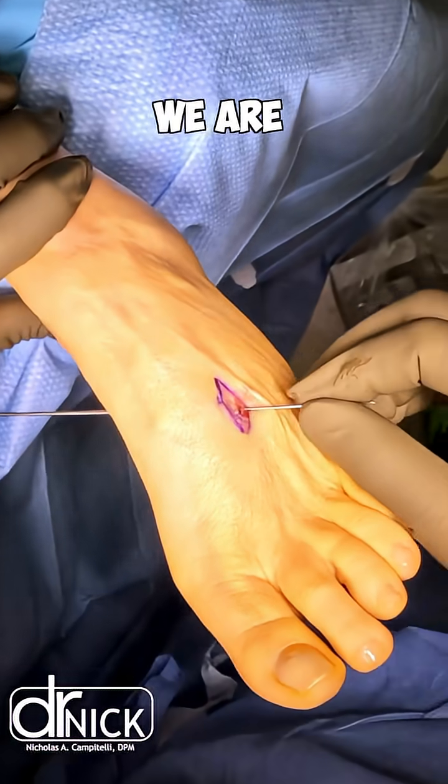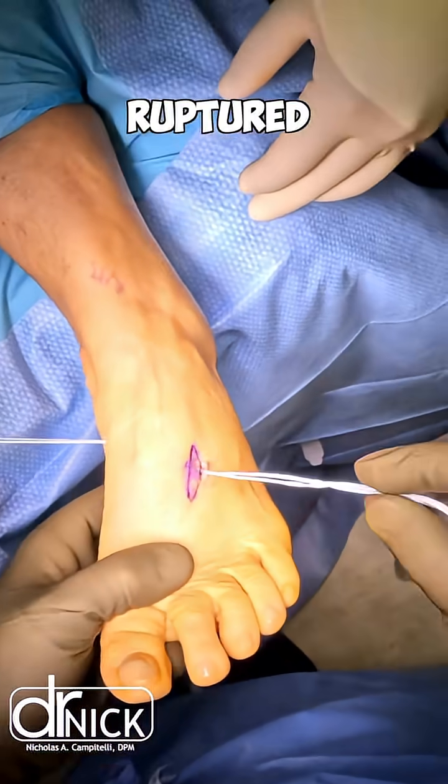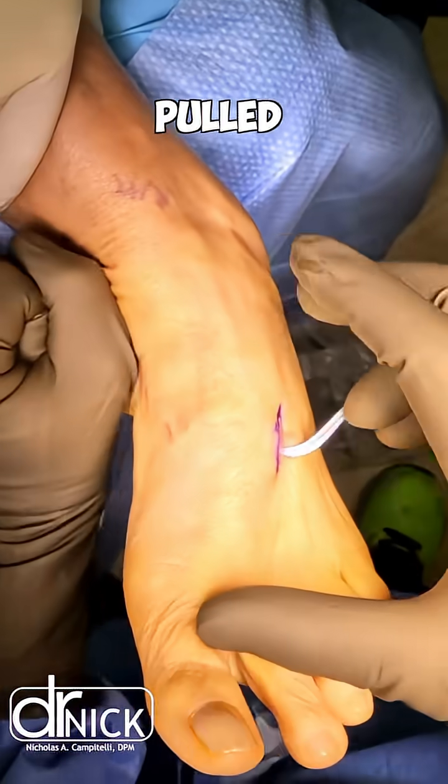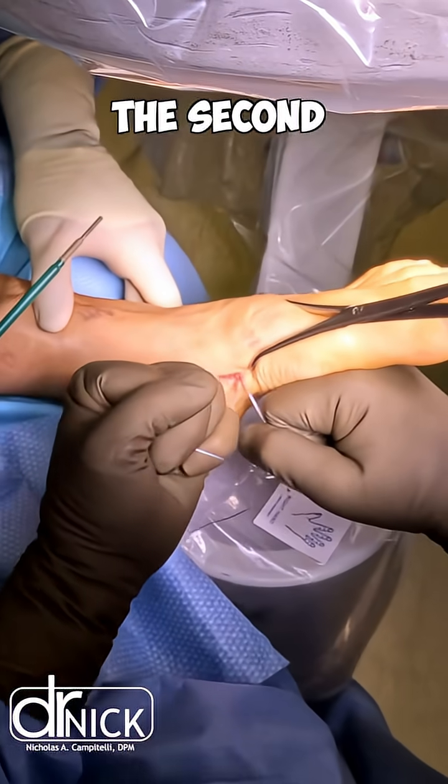You can see we are pulling this nitinol loop to pass our internal brace across the ligament ruptured site. It gets pulled through and then there's a suture button that goes on the lateral aspect of the base of the second metatarsal.